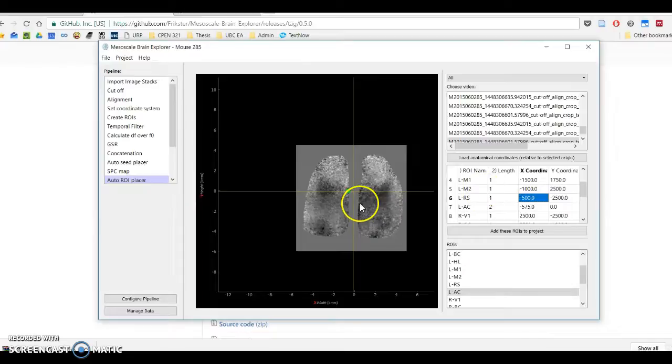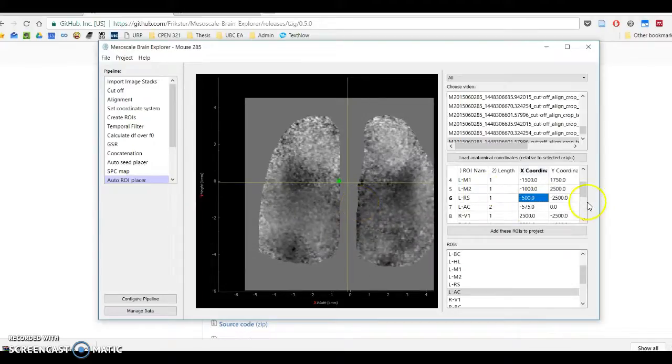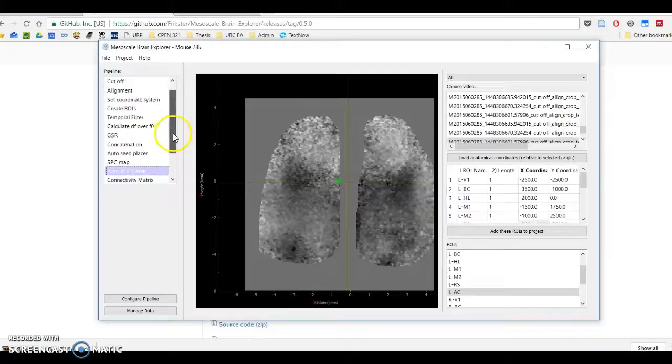This may be changed. The idea is that the coordinates are supposed to be known, taken from like an anatomical atlas, so they're not supposed to be wrong. So it's supposed to discourage nudging them around. And I suppose it's just nice to be able to immediately revert back to what you had. Anyway, so those are those.